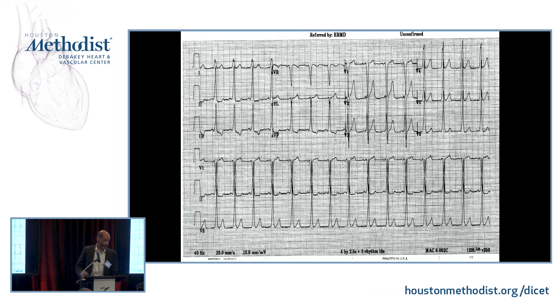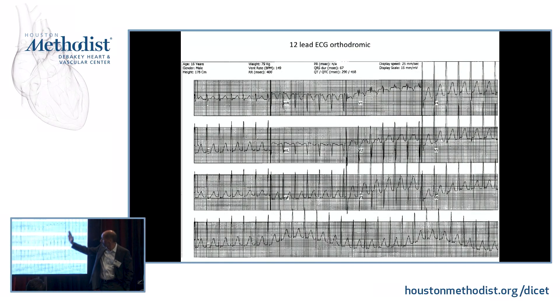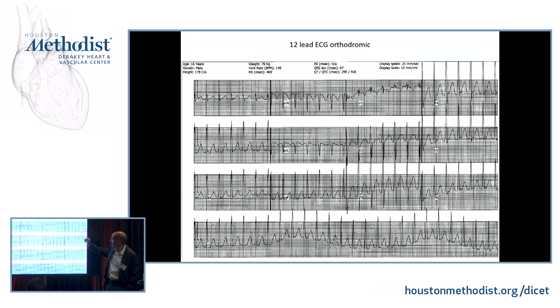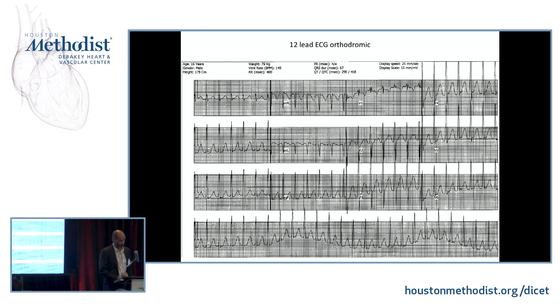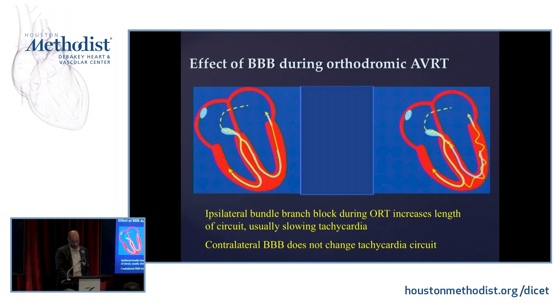When we go into SVT, the delta wave goes away. In this case, the patient had a little bit of right bundle branch block, but the QRS becomes narrower than in sinus rhythm, which is consistent with orthodromic tachycardia.